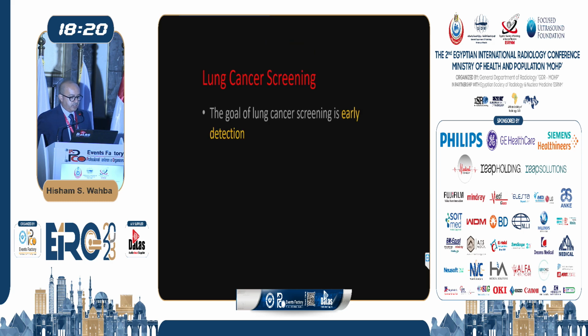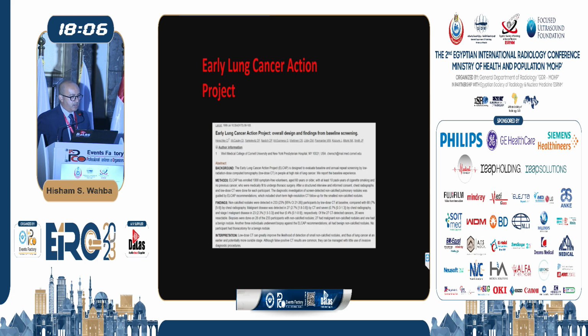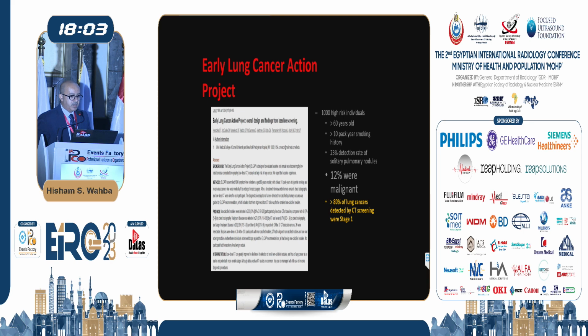Why did they start Lung-RADS to begin with? The goal was to establish one recommended way of discussing lung nodules across all studies. Lung cancer screening started in 1999. When they did lung cancer screening at the beginning, they found that more than 80% of lung cancers were detected at an early stage, with stage 1 disease. From this point, they started raising awareness about smoking cessation and starting lung cancer screening to reduce the possibility of late-stage lung cancer and, by the way, the increasing cost across countries.